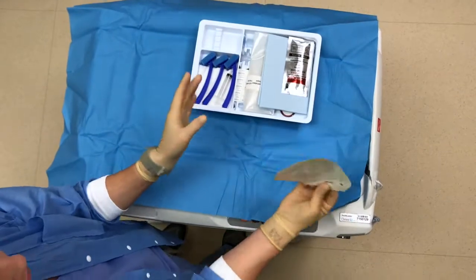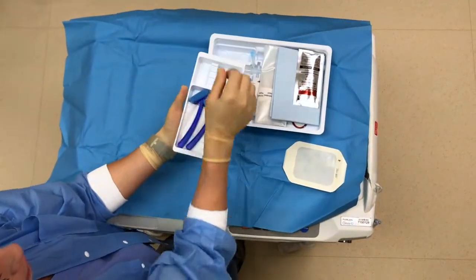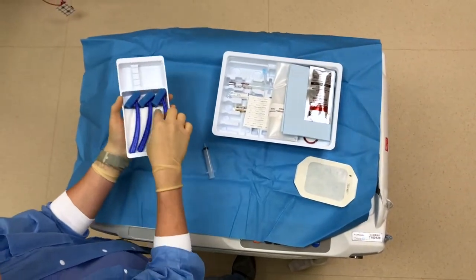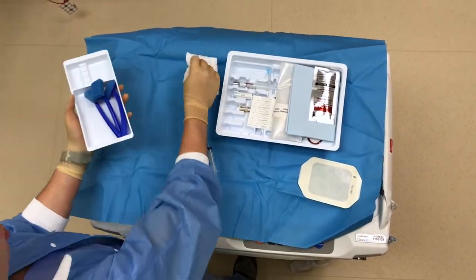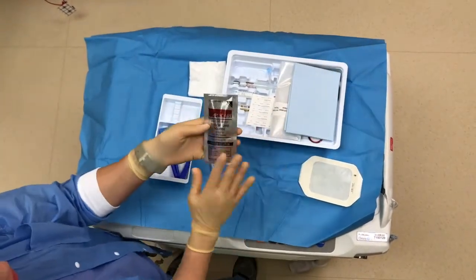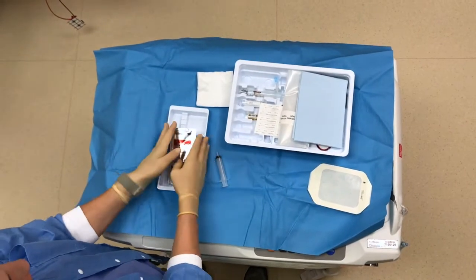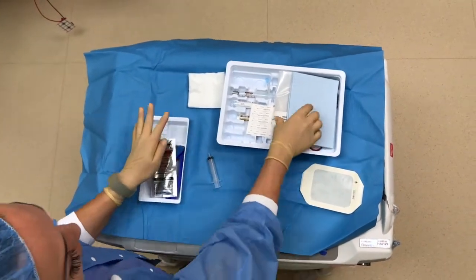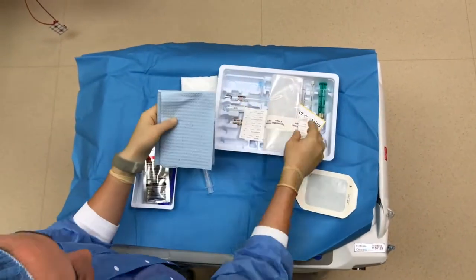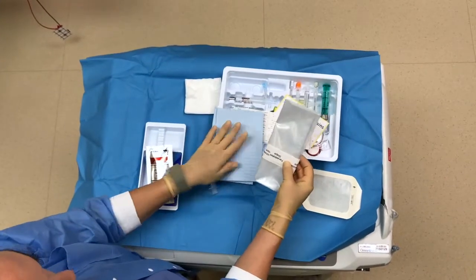So here's your Tegaderm. That'll be the last step. I take out this tray. This is going to be your cleaning tray. This syringe you don't need right now. And I usually take this little gauze pad out and use that separately. Here's your povidone solution. And I put that off to the side with this tray. They go together. Here's two drapes that you'll see that we use to help blot off excess solution.